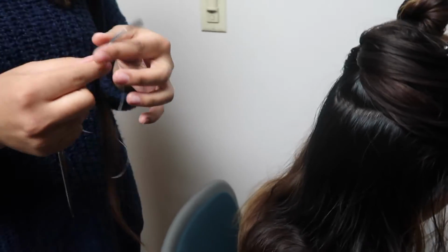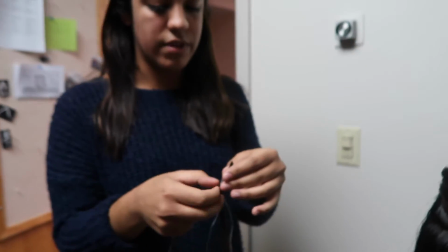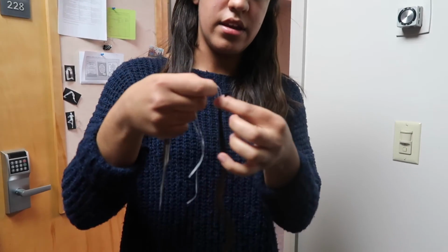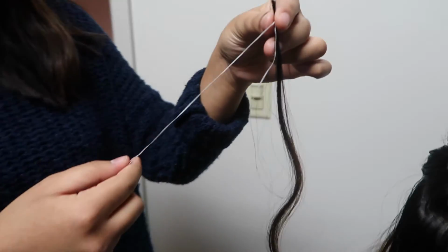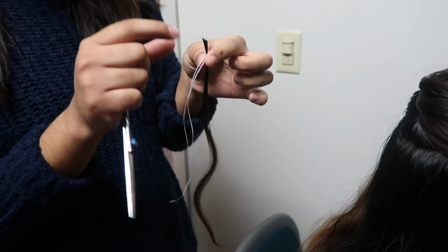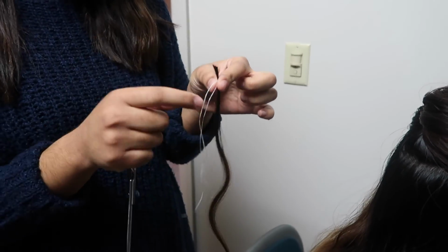And so this is kind of like how your hair sample is going to look. You're going to have the tie as close to the root as possible. And then it's about that much of a sample. And it's a very simple double knot. And this will indicate that this side is the root, so that's where you want your knot to be.